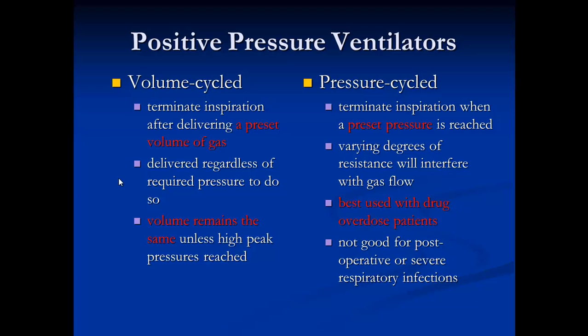It is best used when you have already exhausted your parameters in volume cycle, or basically when you are already at maximum support, 100% FiO2 and a high PEEP.